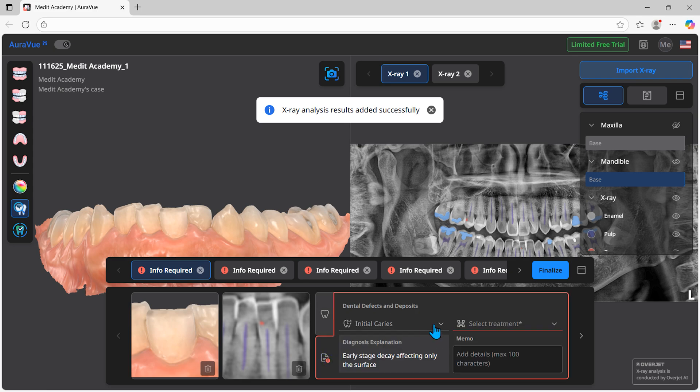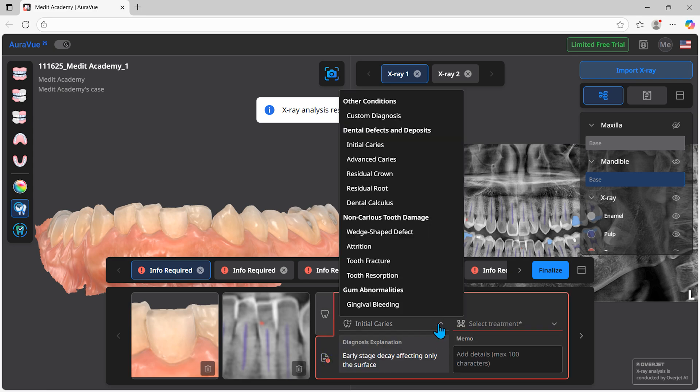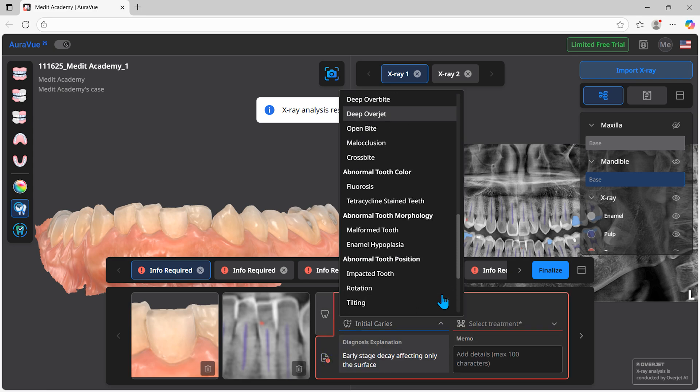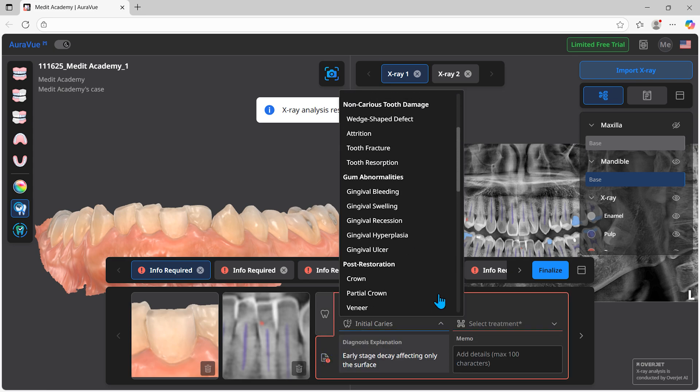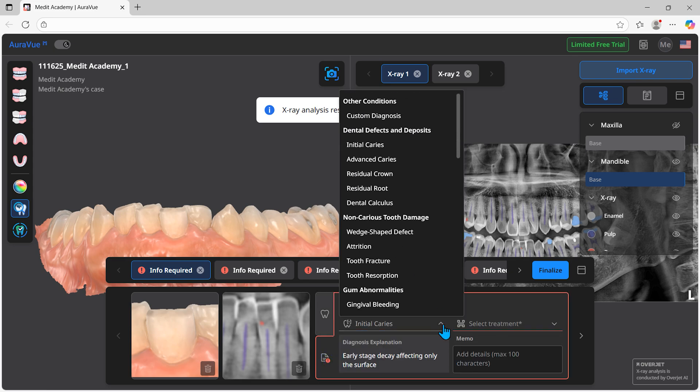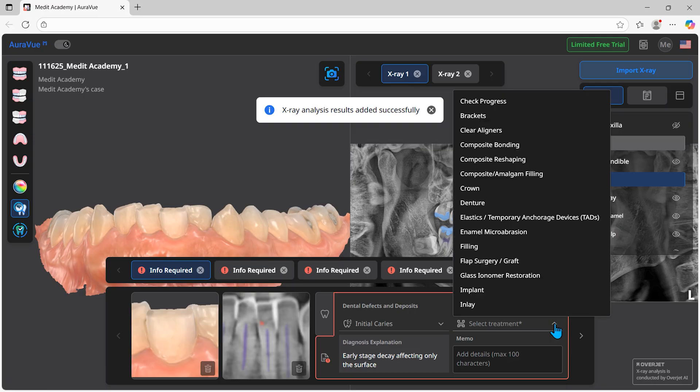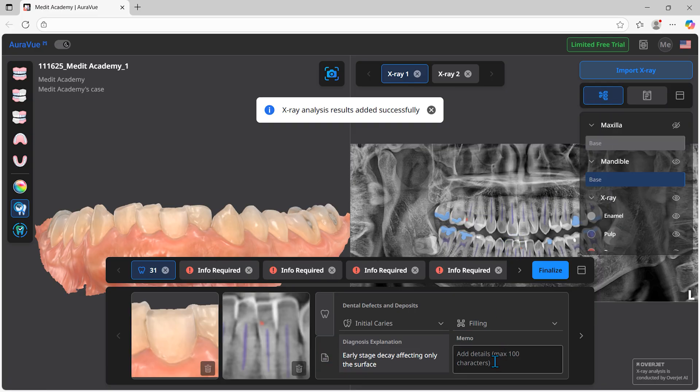Now, let's note the preliminary diagnosis and treatment plan. You can add a summary of symptoms, anticipated treatment items, and memos.